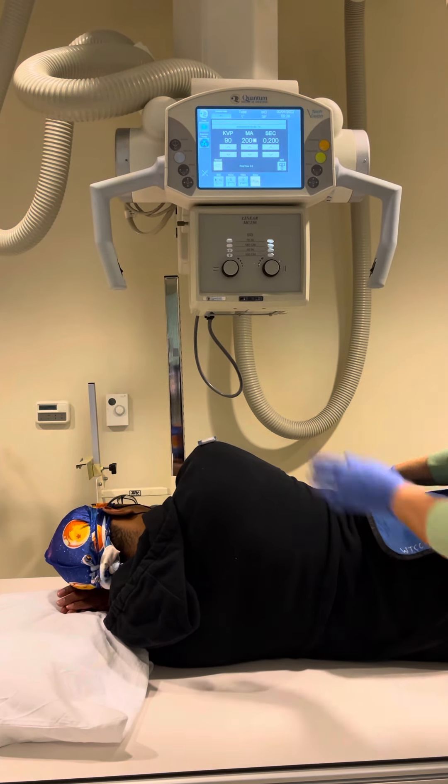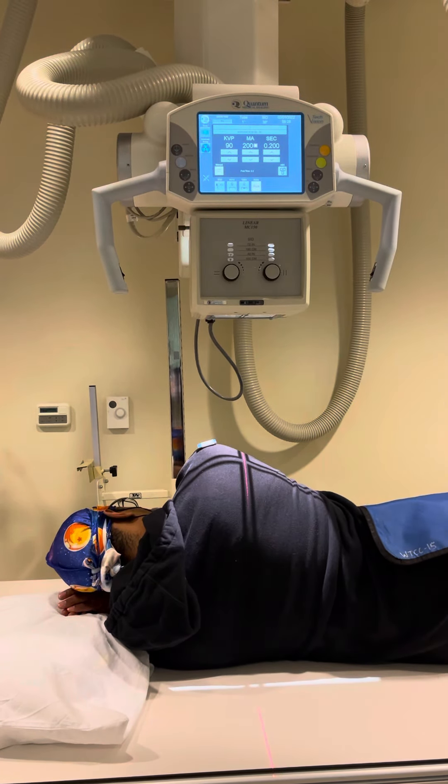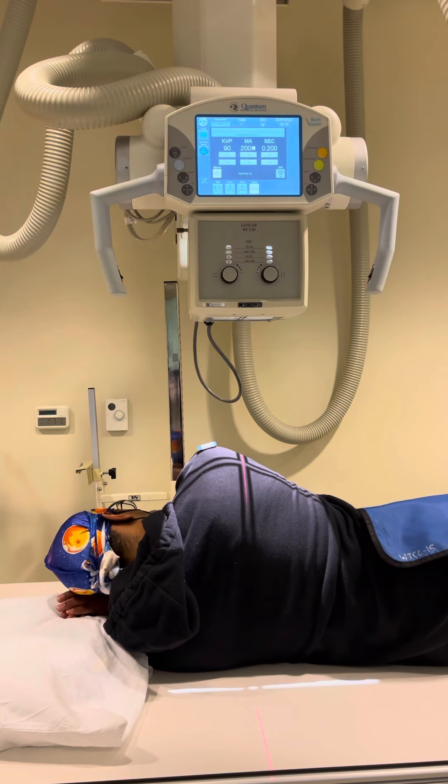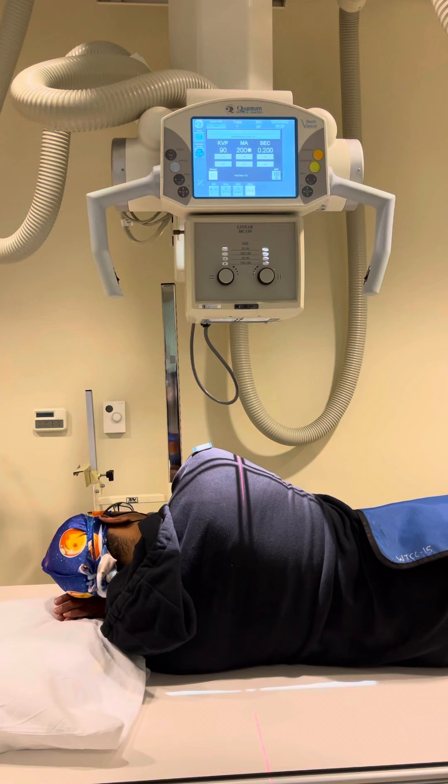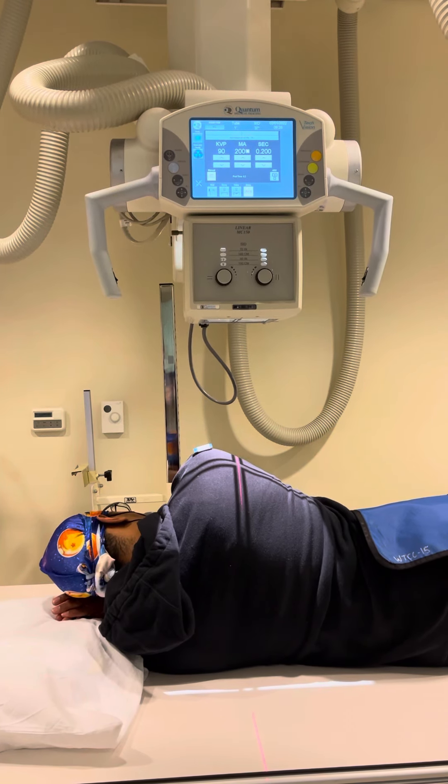Then shield the gonadal area. This can be done with suspended respiration, or with a breathing technique or orthostatic technique, which would give you a three to four second exposure time to blur out the ribs.